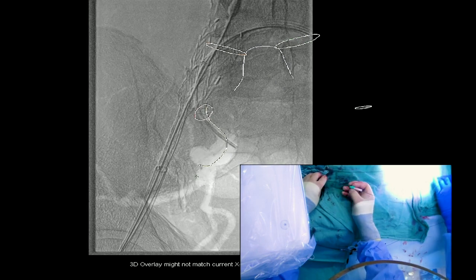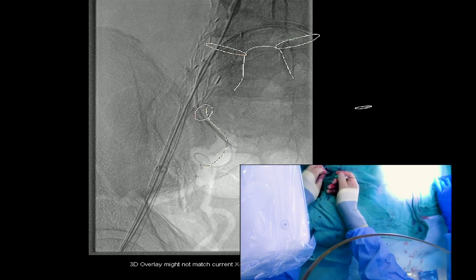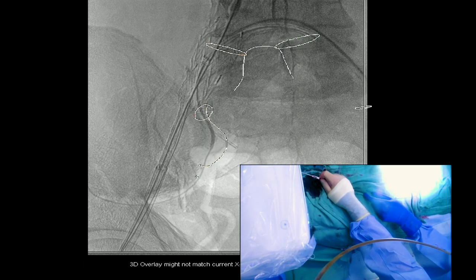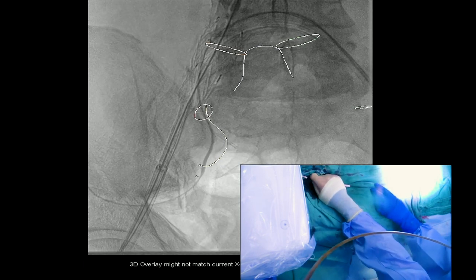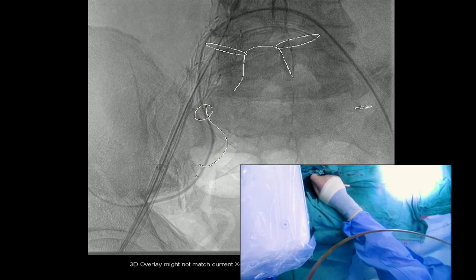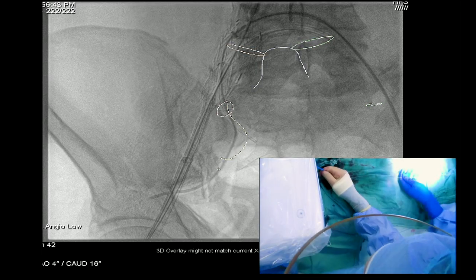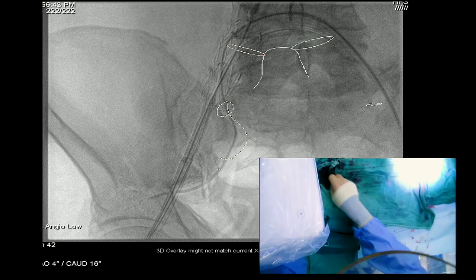Eventually we get the wire out through the superior gluteal artery. We were having trouble because of the proximal position of that catheter — we didn't feel we had enough. Now all of a sudden the wire tracked. One important thing here is the crossover sheath: as you advance the catheter, you don't want the sheath to come back because it can buckle up into the aorta. Here it's coming back a little bit — you just have to keep an eye on that and keep advancing the sheath. You've still got to get the internal iliac limb up and over, so you've got to have the sheath inside that IBE device.